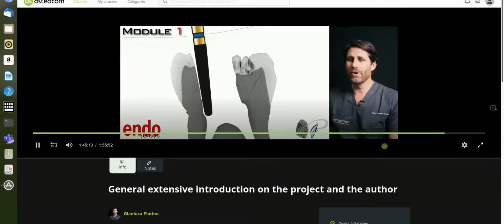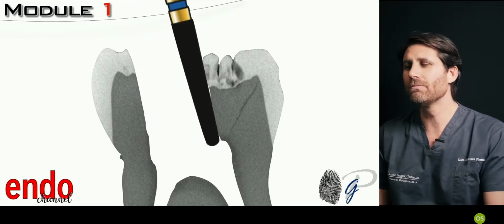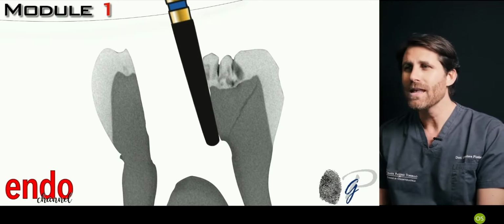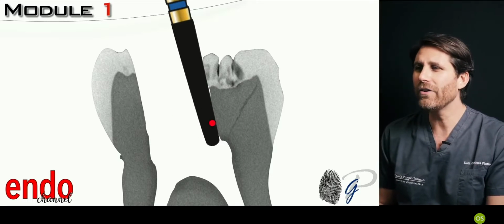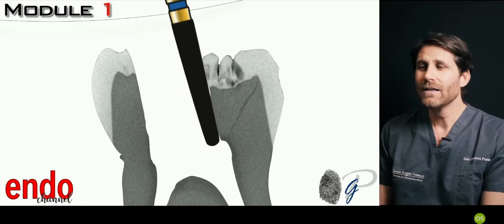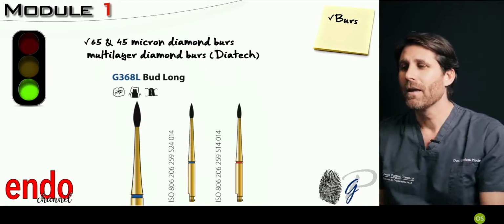I like this tapered burr because it reduces the possibility to overextend, to over-enlarge the access cavity with divergent axial walls. And moving this burr, this is the first step, the initial step of opening the access cavity, with all the concepts that we have already underlined, preserving as much as possible the soffit, the pericervical dentin, but accessing the root canals.